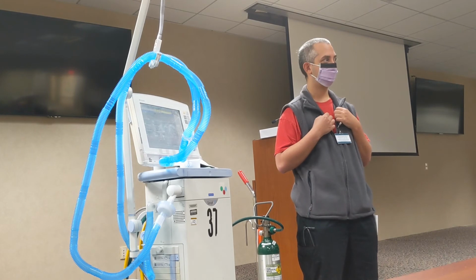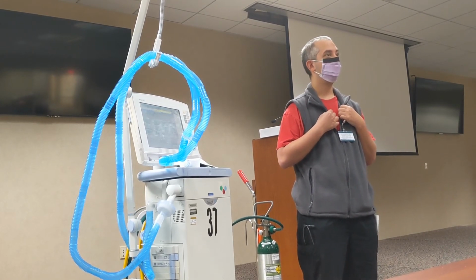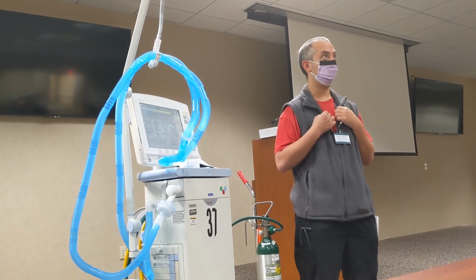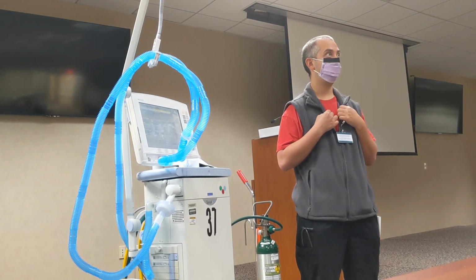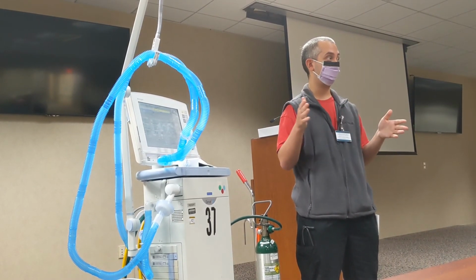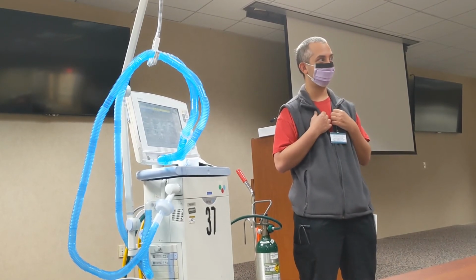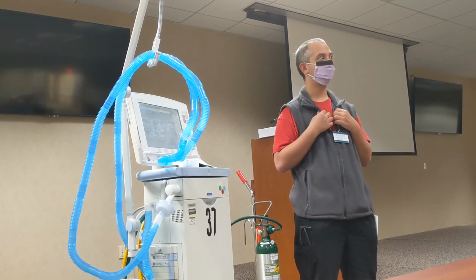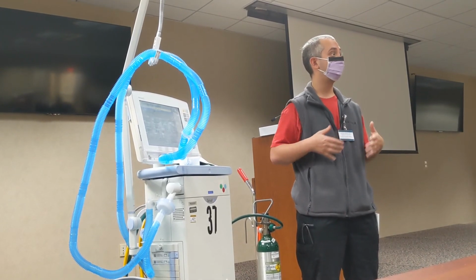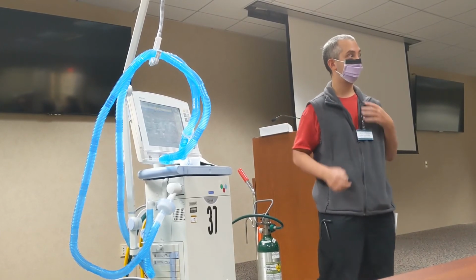How long would you leave them on APRV just to see if it's going to be successful? Some people, it truly takes hours, upwards of 10, 12 hours to see how much you're actually going to recruit. So probably upwards of 10 to 12 to 24 hours to see how much of the lung is actually recruitable.